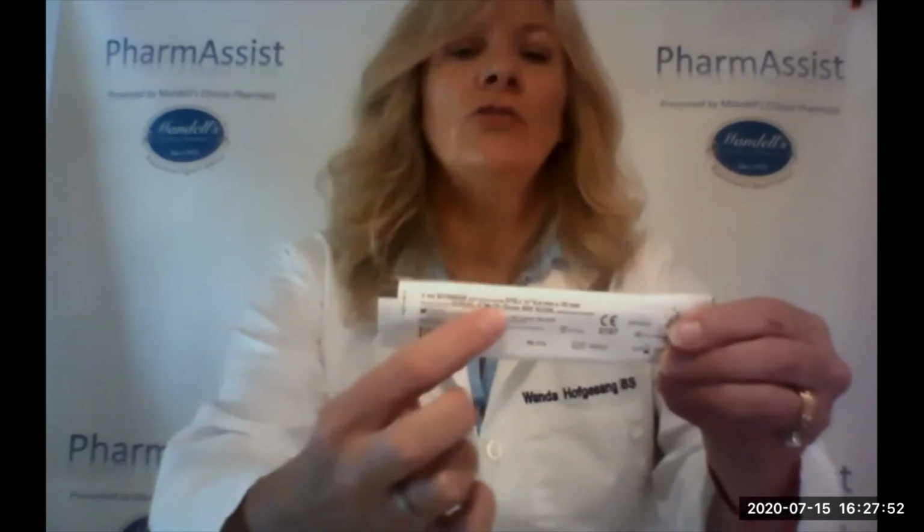But for everybody that uses a multi-dose vial, there is typically more than one injection in here. So that's what you just want to know, is once it's empty, you'll know, because you won't be able to draw out any more of that medication. So in the very first night, it's nice and full. And then what you do is you take your needle that says 1 ml syringe, 27G ½ inch, and you open it from its package. It's sterile in there.